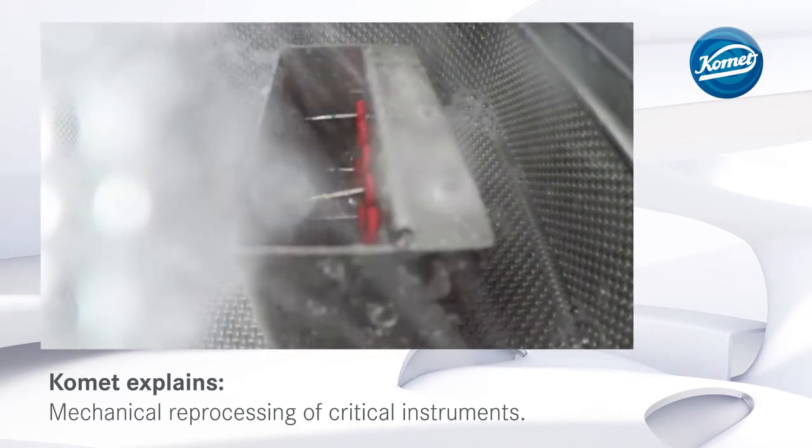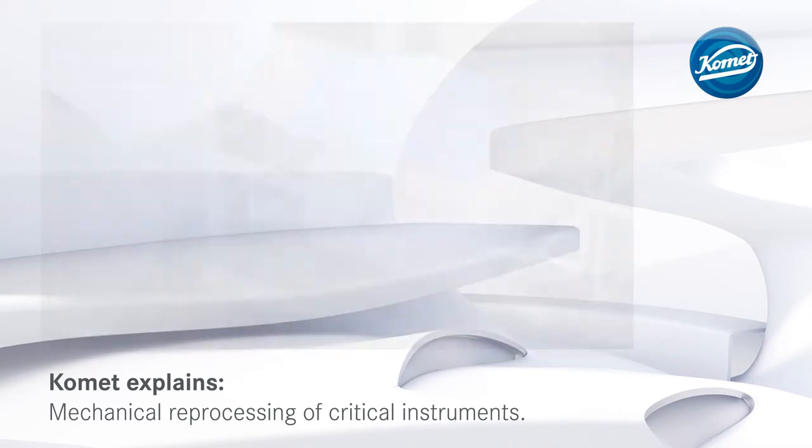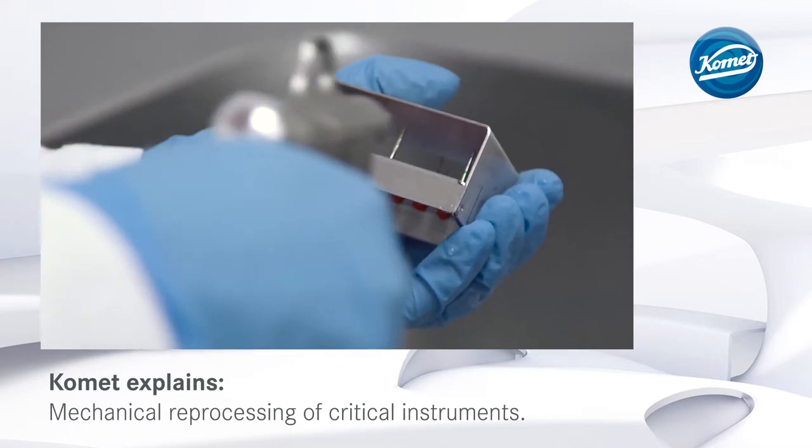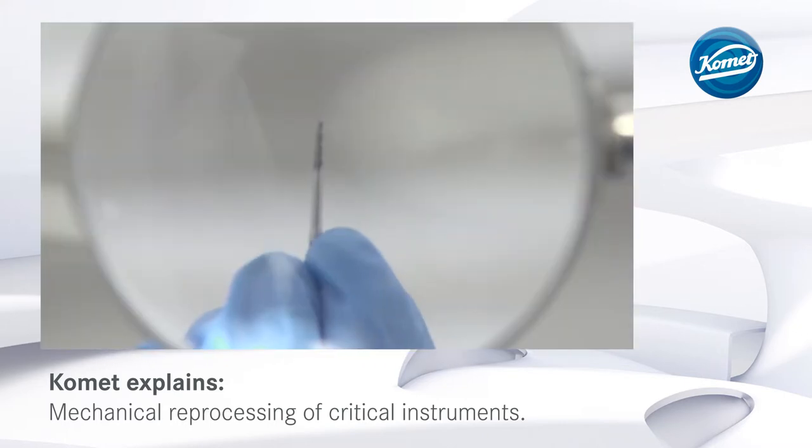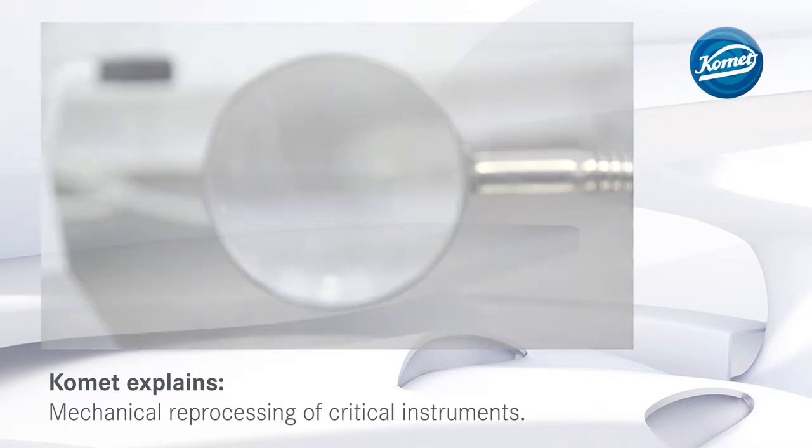After completion of the program, remove the burr block from the thermo-disinfector and dry with compressed air. This is followed by a visual inspection with magnifying glasses. Worn instruments have to be discarded.